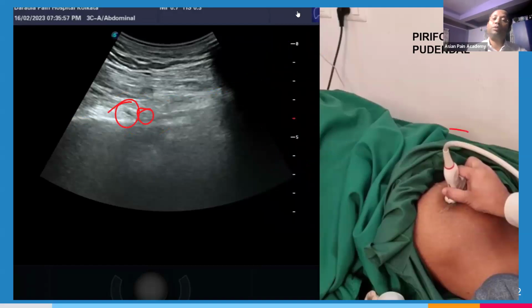So with this needle positioning, my needle will come from the medial side to inject in the lateral side. Okay, like this. I will not go in the opposite direction, because why? Otherwise, I will puncture the artery. Most of the time, it is possible that the artery is just a bit covering the nerve, not covering, but still you can puncture the artery. This is the nerve actually. So it is better to inject from the medial side. Okay.